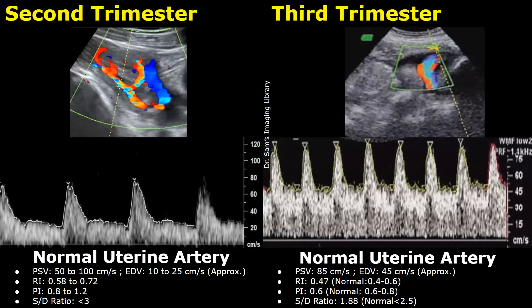In the third trimester, we will find a low resistance waveform. The range of PSV and EDV is similar to the second trimester. The normal resistive index range is between 0.4 and 0.6 — in this example it is 0.47, so that is normal. The pulsatility index can be between 0.6 and 0.8 — in this example it is 0.6. The SD ratio is usually less than 2.5; in this example it is 1.88, so that is normal.